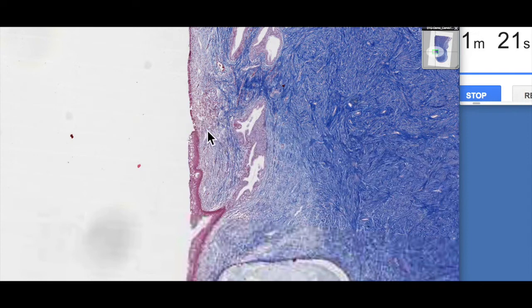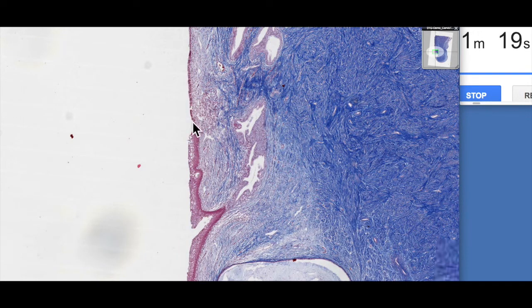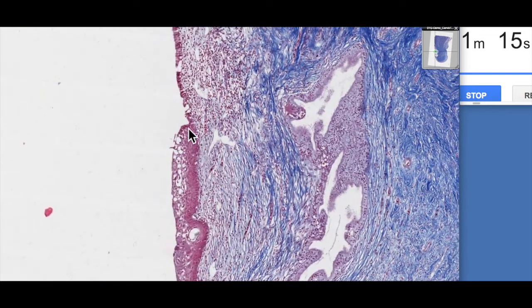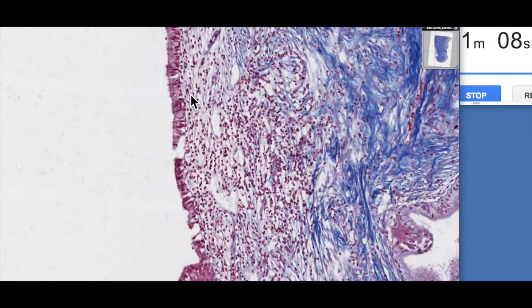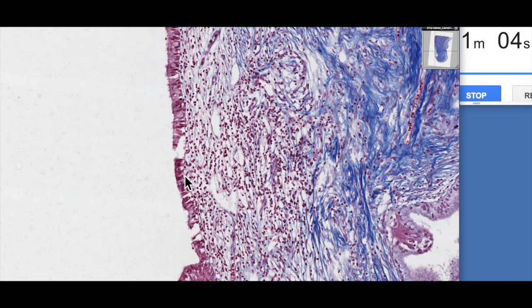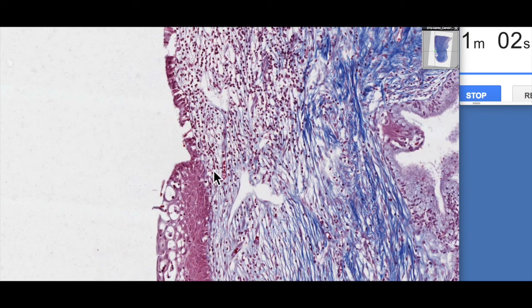We see the junction or the transition between the endocervix and the ectocervix. We can see this region here. Here's the stratified squamous non-keratinized epithelium of the ectocervix. And the endocervix is lined by a simple columnar or a pseudo-stratified columnar, ciliated columnar epithelium. You can see lots of immune cells present here.